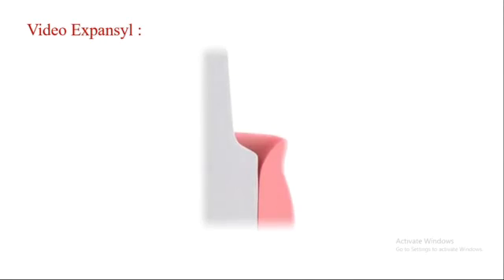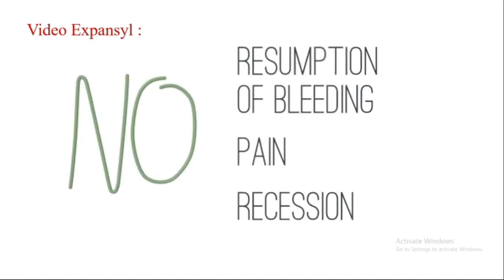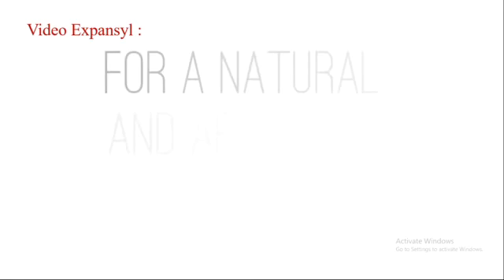Expasyl paste has the advantage of easy removal. It does not resume the bleeding. Also, because of the minimal tissue injury, there are decreased chances of gingival recession.